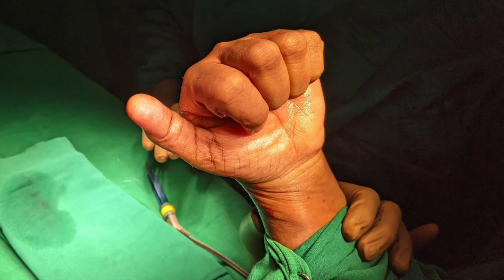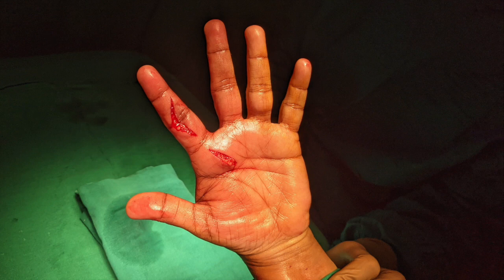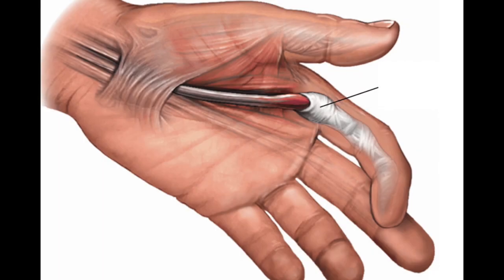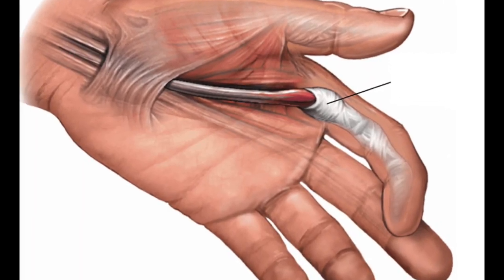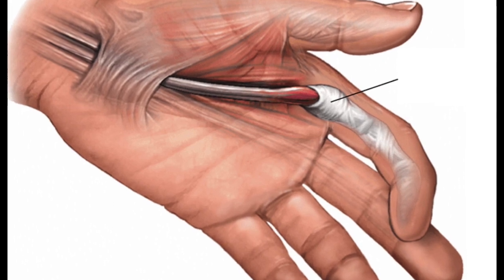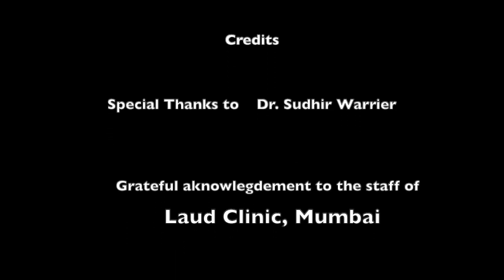Once the trigger digit is released, the patient is asked to actively flex and extend the finger to confirm the completeness of the A1 pulley release and to ensure that there is no triggering. Isolated trigger digits are routine and with some experience, they are straightforward to deal with surgically. One must be aware of the associated conditions that may require additional surgical steps to achieve a good postoperative outcome.